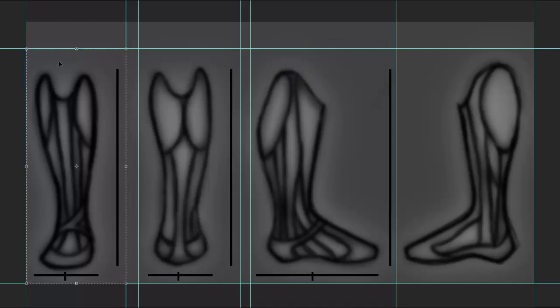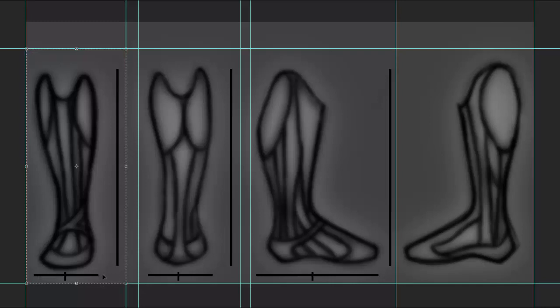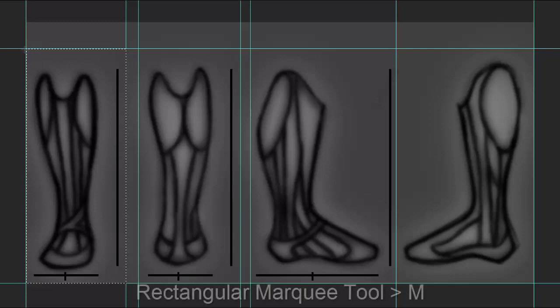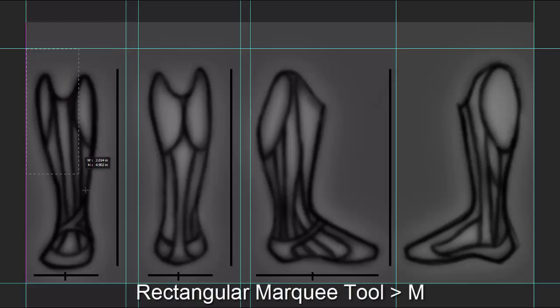Now what I want to do is output each one of the images. I want to make sure that when I output the images, I capture this vertical reference line and this horizontal reference line. We're going to use these to scale our model once we get it into Rhino. I'll do that by getting my Rectangular Marquee Tool, which is M, and I'm going to select this area.